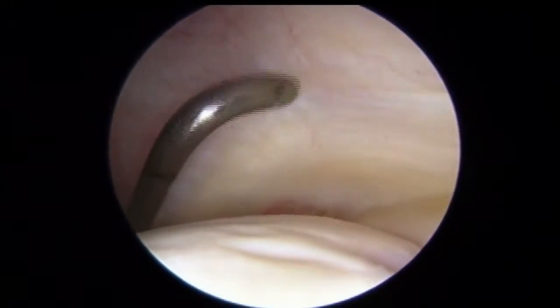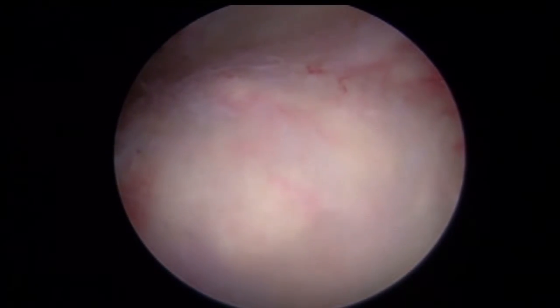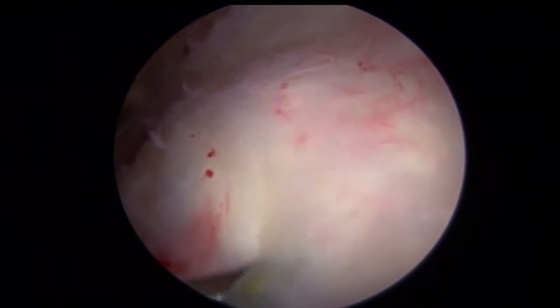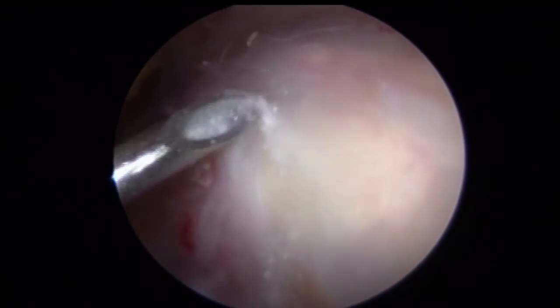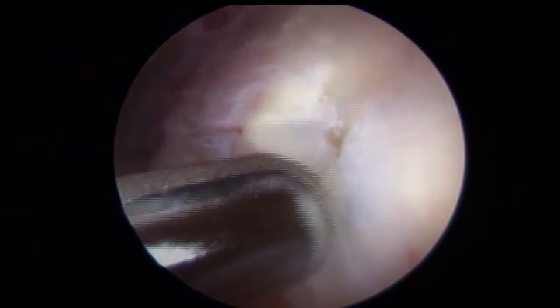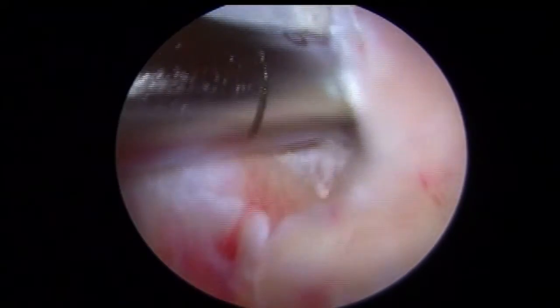Diagnostic arthroscopy revealed that the articular surface of the rotator cuff tendon was found to be intact. All intraarticular pathology should be addressed at this time. Following an adequate subacromial decompression, the bursal side of the rotator cuff is examined. This is a view of the rotator cuff with the arthroscope in the anterolateral portal of the right shoulder. Gentle probing demonstrates that the supraspinatus tendon is softer than normal. A spinal needle is first inserted into the supraspinatus tendon to identify the area of calcification. Next, an 11-blade knife is inserted through the rotator cuff tendon in a longitudinal fashion to allow for excision of the chalky white calcium deposits. An arthroscopic shaver is then inserted into the supraspinatus tendon, and the calcium deposits are extravasated and removed from within the tendon. In this case, the calcium deposits extended into the infraspinatus tendon as well. It is important to remove all calcium deposits from within both the tendon and subacromial space, as these can be very irritating and cause significant inflammation if left behind.